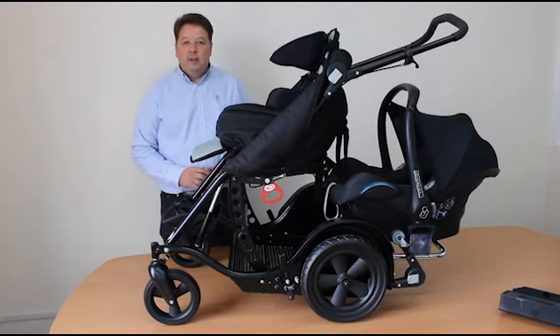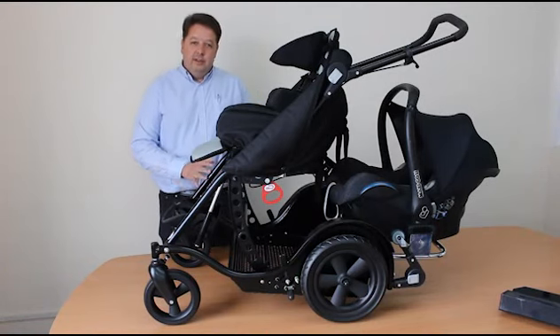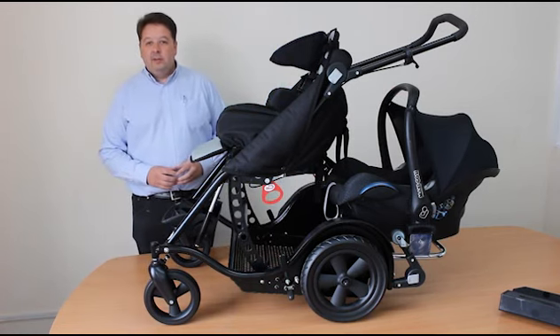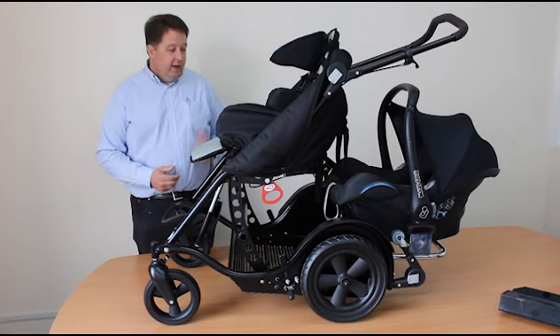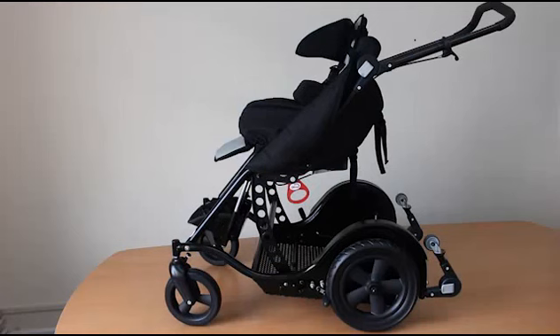Here is the tandem buggy, a buggy designed for children with special needs. They travel in the front, and there's an extra seat or baby carrier at the back for a younger sibling. The tandem buggy has been a very popular product — it's the only product we know of that provides proper postural support up front, can function entirely as a single buggy for school, and the rear attachments can be taken off and added as required.